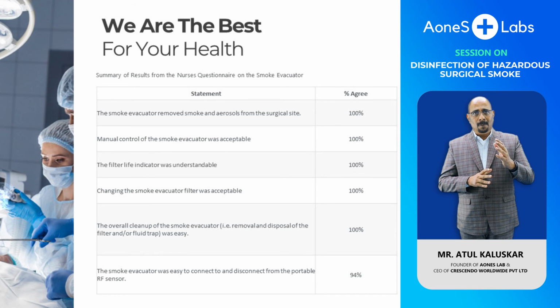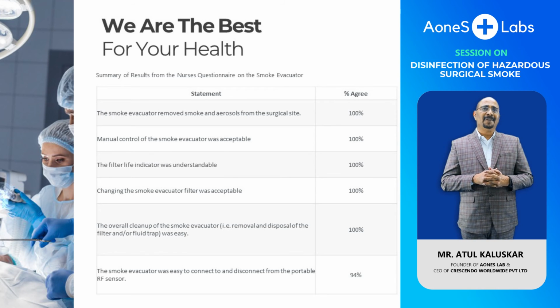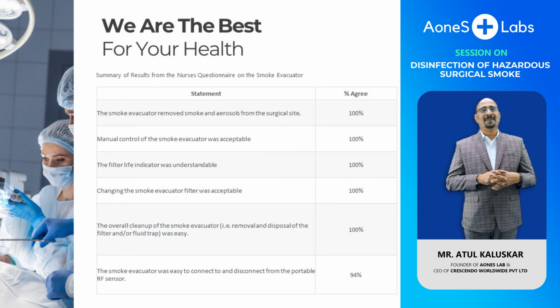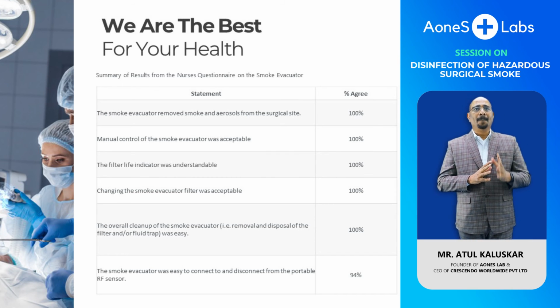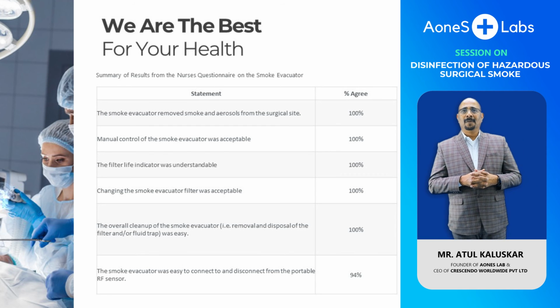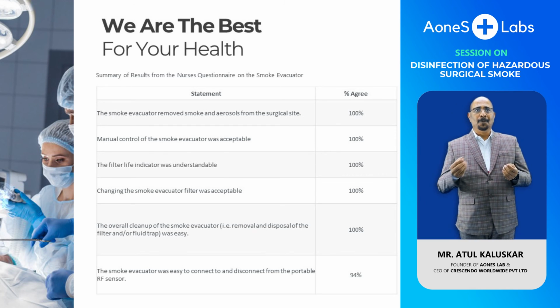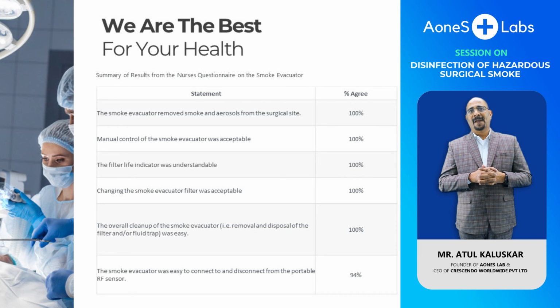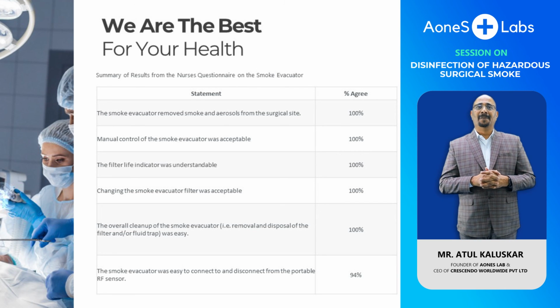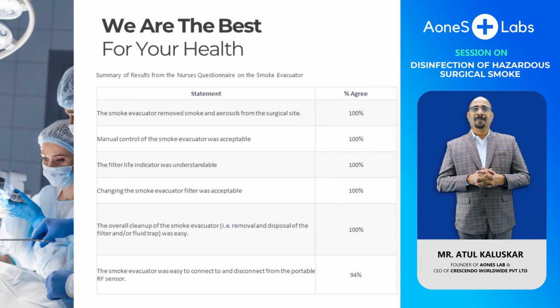Now for laparoscopic surgery, per se, it is easy to collect the smoke because it comes directly from a tube. But for open surgery, there is a challenge to collect the smoke. In minimally invasive surgeries, the trocar end is connected with a simple silicone tube and the smoke is collected and can be disinfected, although it is not done at many places.